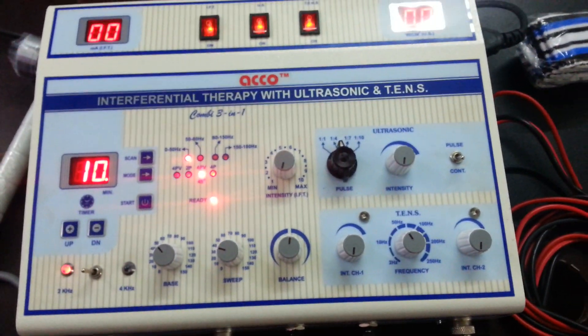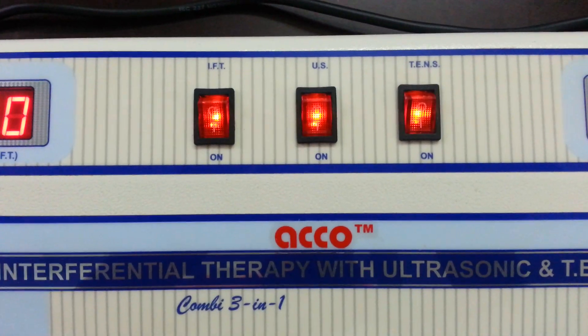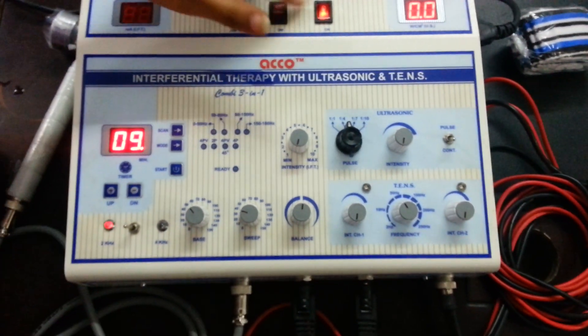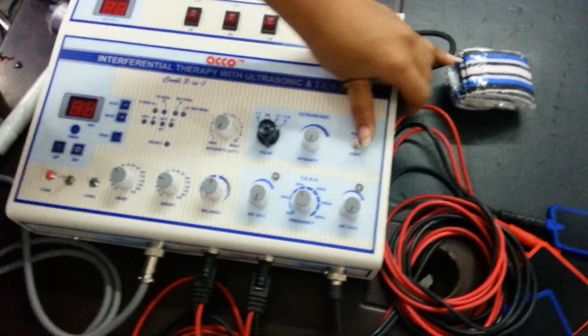The demo is completed. All three therapy units can be used at the same time. Switch off the machine. Thank you.